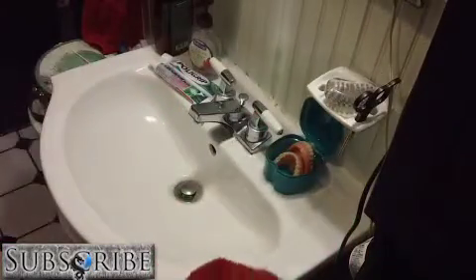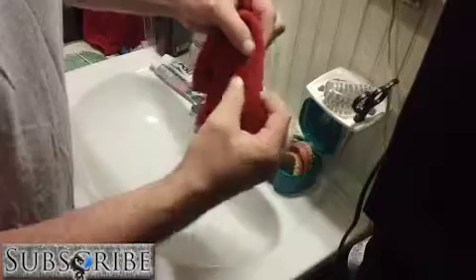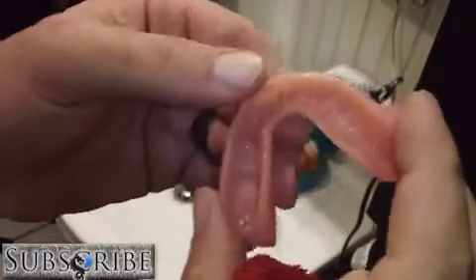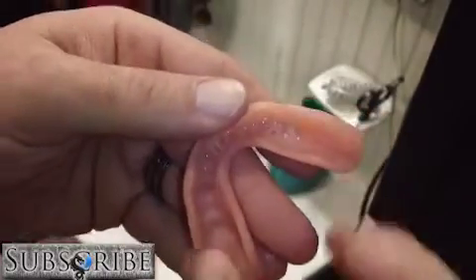But if you clean them really good, drying them off is no different than drying your hands on it, except those are more sanitary. They've been sterilized, basically. So I will take this washcloth here, fold it like that to bunch it up, because I want it to be kind of poofy to get in all the grooves. It's kind of hard to see here. See if we can turn the light on, a little extra light. Of course it doesn't really want to focus very well. You can see it's wet, and there's a lot of little bumps and grooves because that was the contour of my gums when they took the mold.